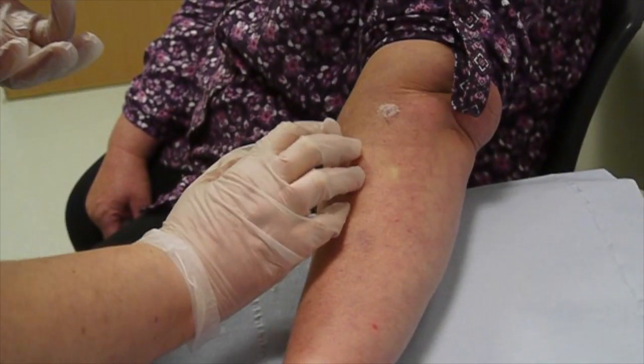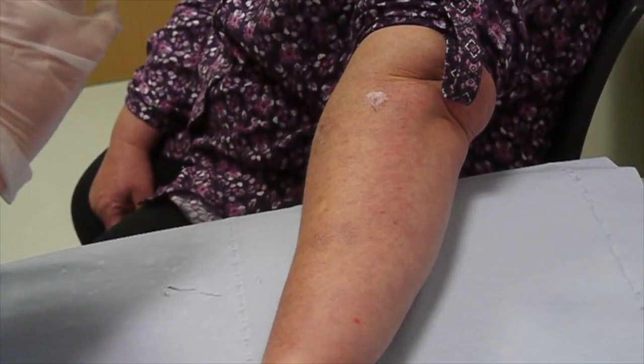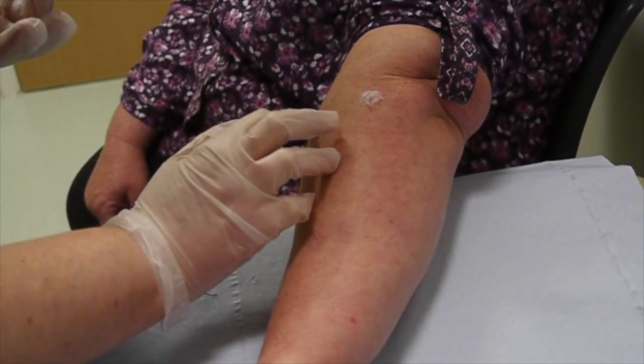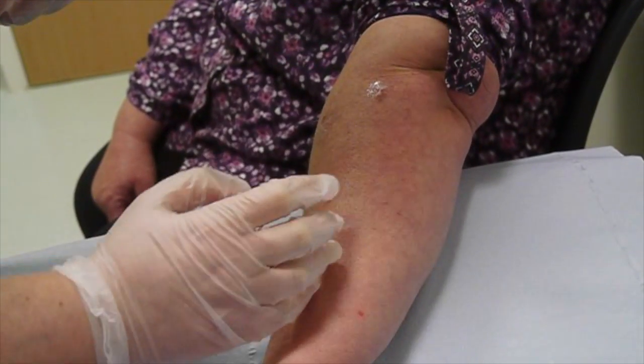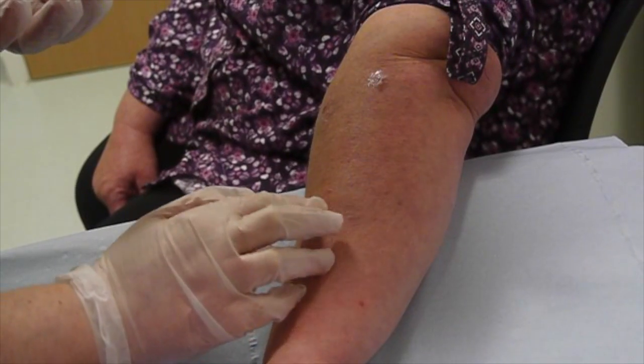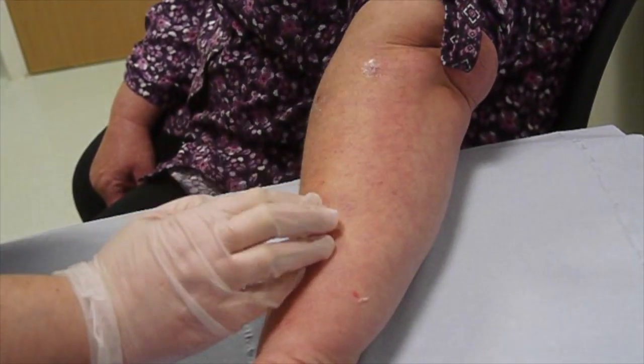The strong steroid ointment is put accurately over the patches of eczema, and these are shortly going to be covered by the hydrocolloid dressing.